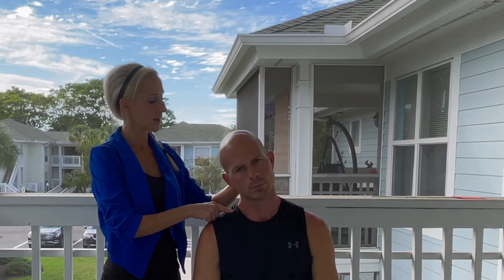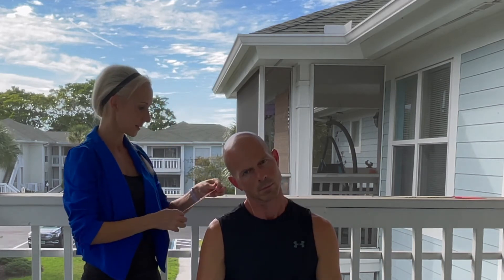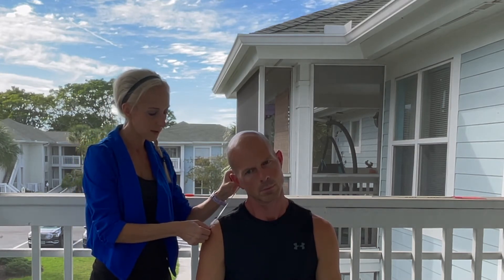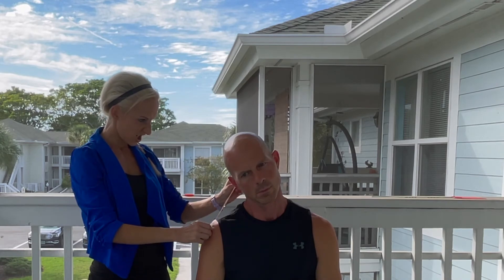Side bending is very similar, but on this one I'm going from the mastoid process right behind the ear — the temporal bone — to the lateral tip of the AC joint. Let's side bend your head. Notice Cory bent his whole torso — let's come back up, reset, keep those shoulders level. Go ahead and side bend that head. Good, stay right there. Mastoid process — I can palpate the bone right behind the ear — to the lateral tip of the acromion.